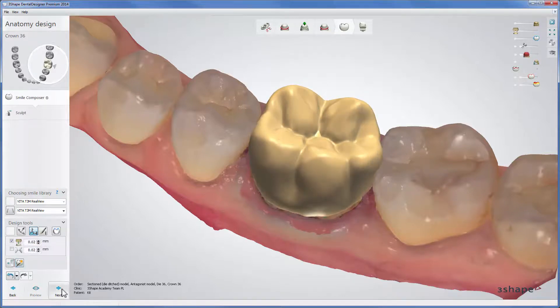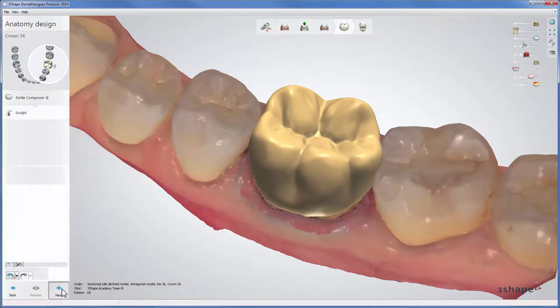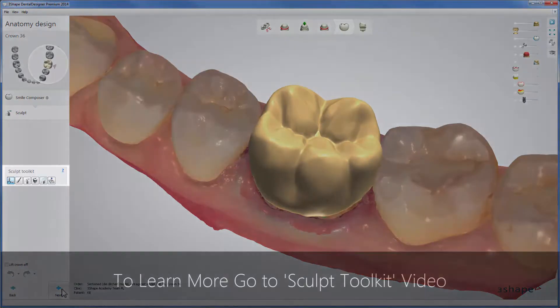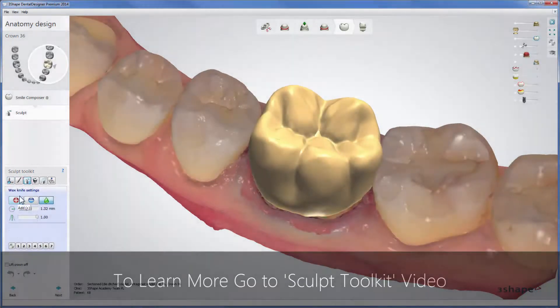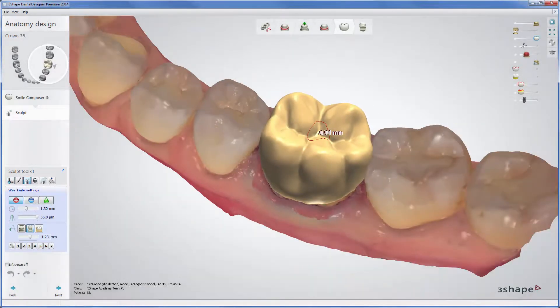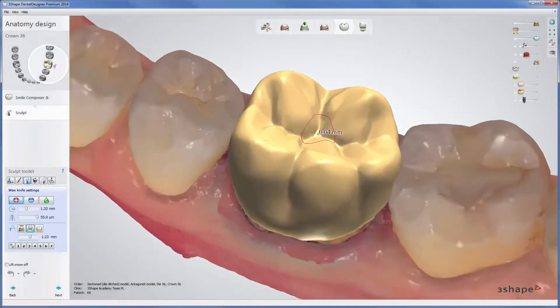Click Next to go to Sculpt and use the Sculpt Toolkit. The Sculpt Toolkit allows you to individually modify the design using tools like Global Transformation, Morphing, and Waxknife.